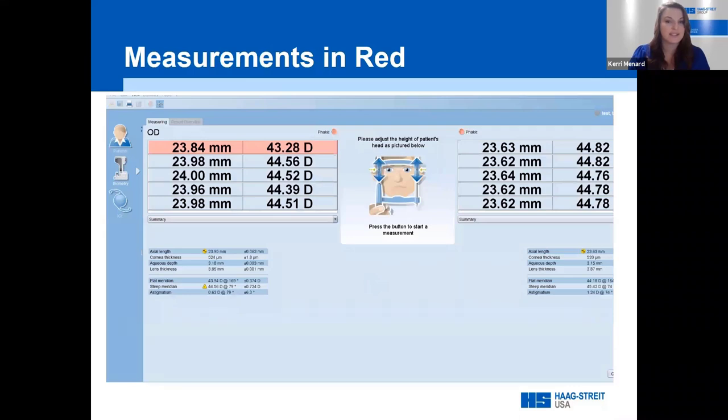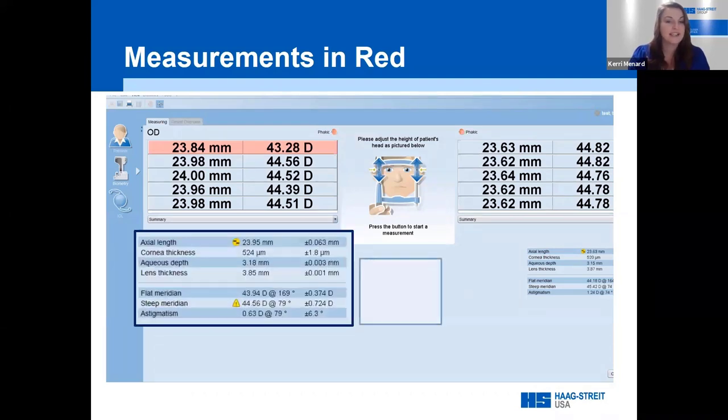Reviewing the standard deviations before deleting a red or pink scan: the standard deviations for the flat and steep meridians (K1 and K2) were 0.374 and 0.724. The recommendation for keratometry standard deviations is less than 0.25. By deleting the scan highlighted in pink — where the average K is a diopter flatter than the other scans — and remeasuring, the standard deviations should reduce if the repeated measurement is closer to the remaining four.